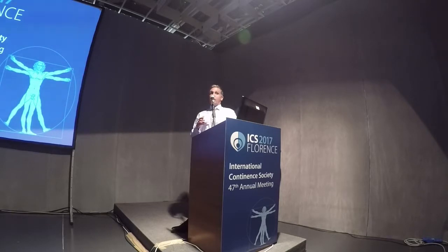However, what we know from this study and then looking at those with symptoms, there may not be correlation for all of the rectoceles, but those that you see on ultrasound pelvic floor imaging are the ones that will be significant on defecating proctography or MRI proctography. So we use it as our first test because it's cheaper and easier. If you don't see anything significant on the pelvic floor ultrasound, you're unlikely to see anything further off. So it's our starter test.